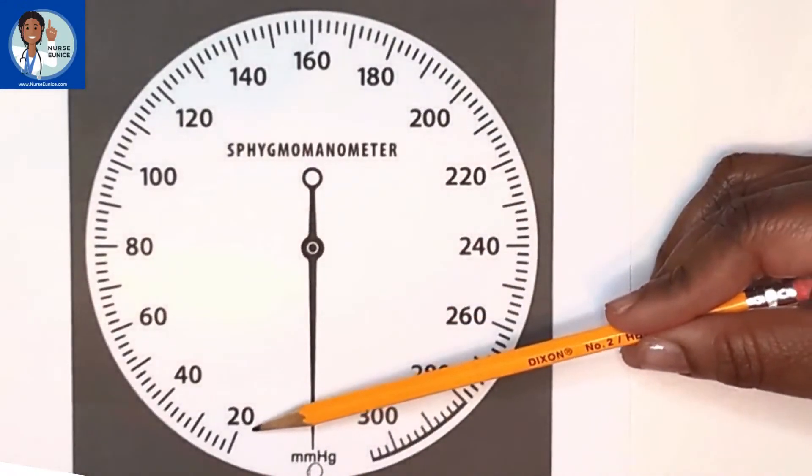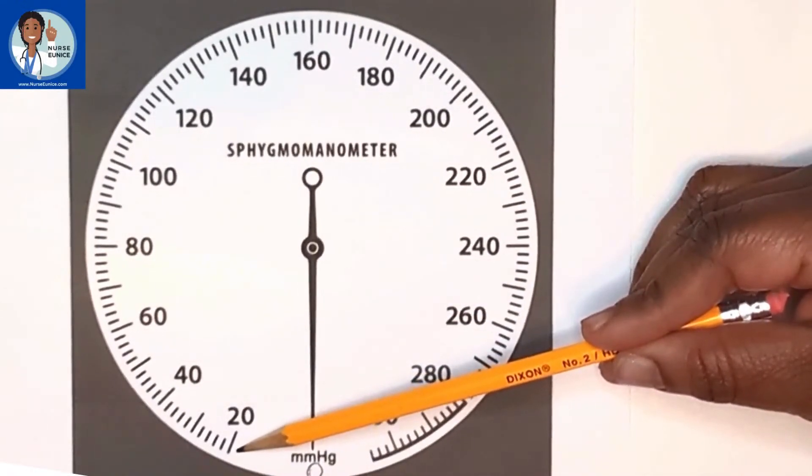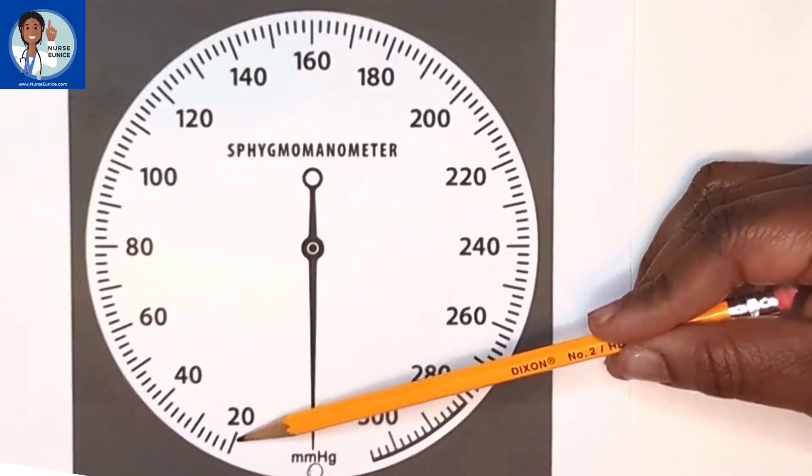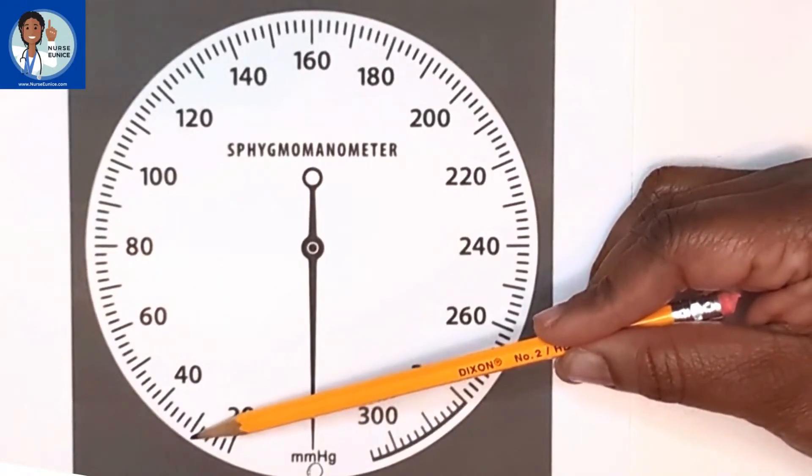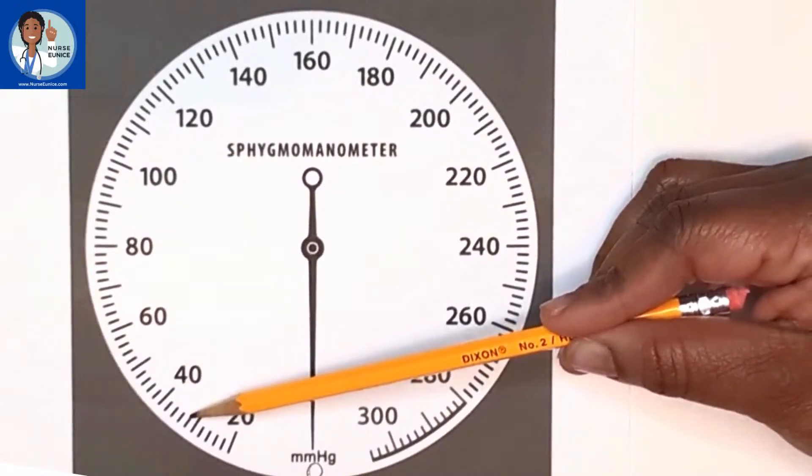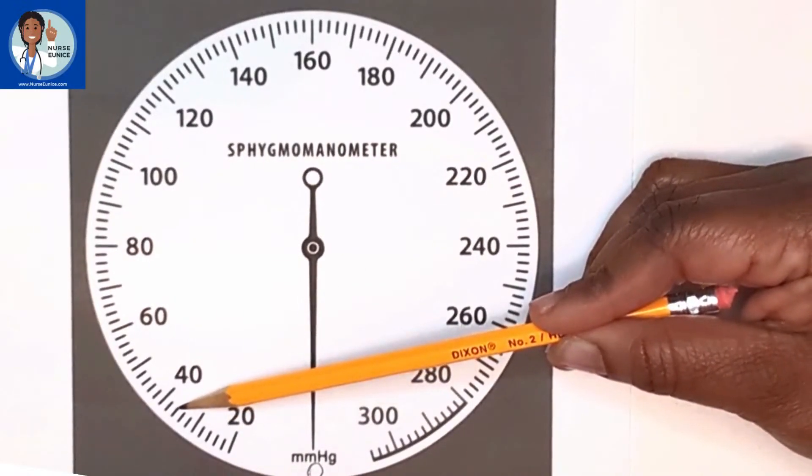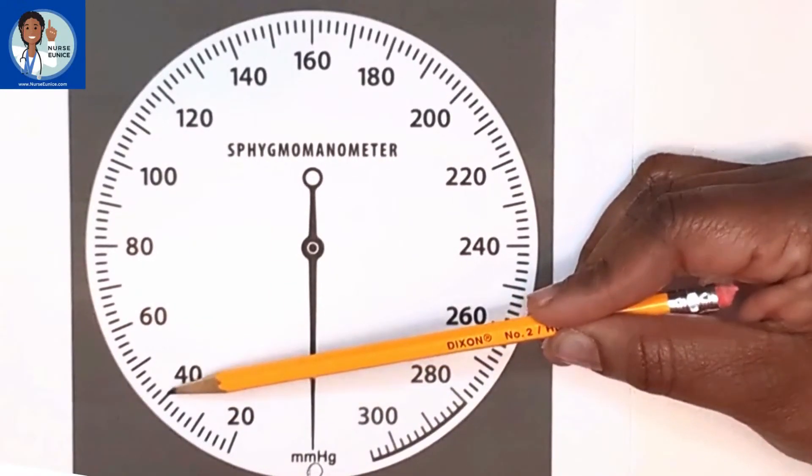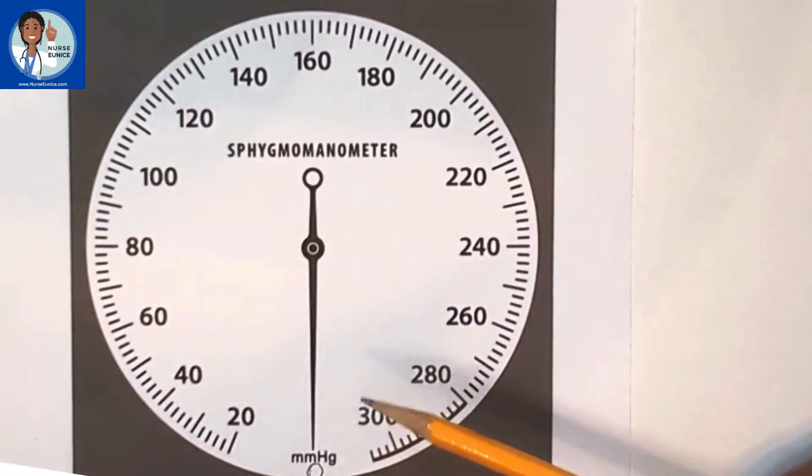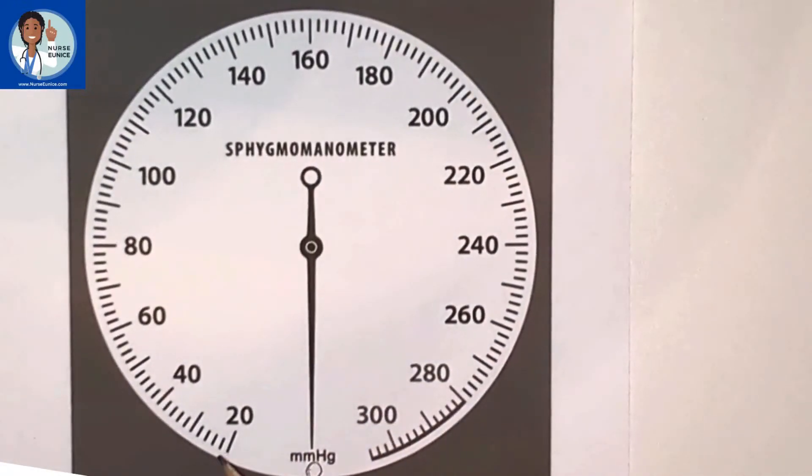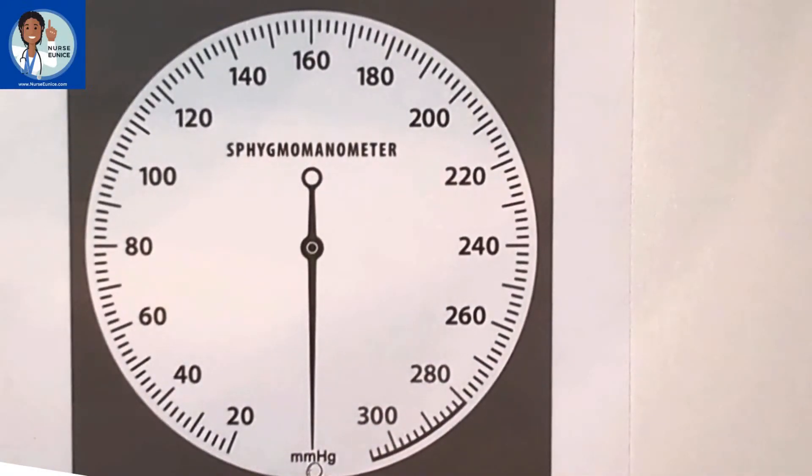Here we have a dark line, a long dark line, followed by four short lines, another long dark line, followed by four short lines, and then another dark line. This is how it reads. Everything's in increments of two. You cannot get an odd number when you're taking a manual blood pressure.